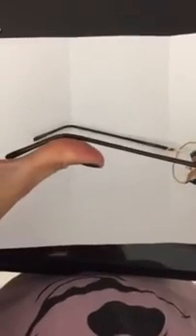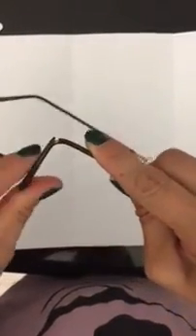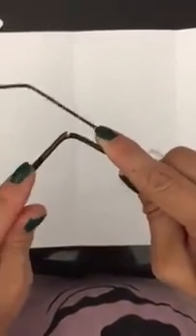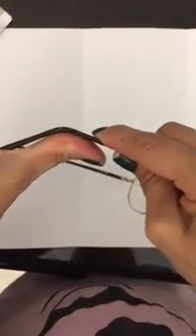It should be 90 degrees approximately. Right here is perfect. Too much bend is bad for the patient. Also bad for the back of the ear. And as you can see, excessive bend can cause damage to the frame. So you want a 90-degree bend, just like the arc of your finger.